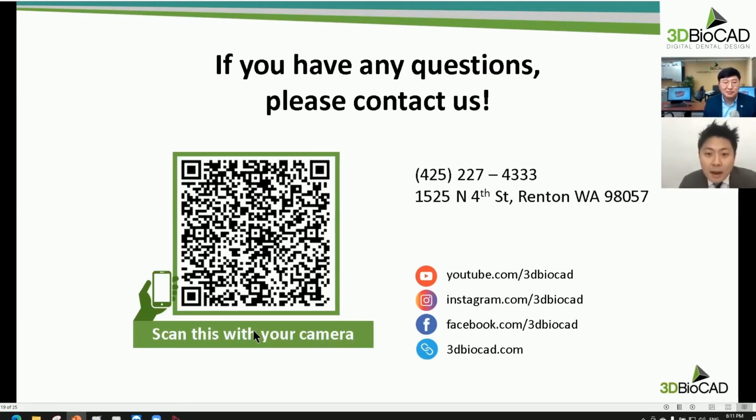Okay. Now, Dr. Donald Cole asks, if the reline is done outside the mouth for an immediate provisional, how do you capture the socket, how do you support the socket, and how do you make sure that it fits? The way I do this is that when the lab is designing the temporary shell crown, they make it in an ideal position. Let's say your soft tissue contour, the gingival margin, is ideal before you took the tooth out.